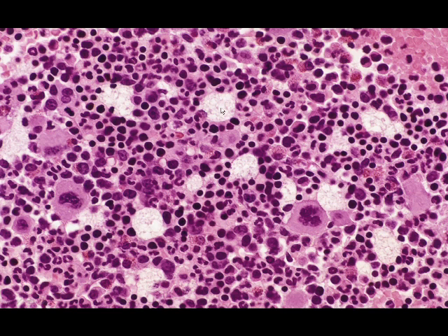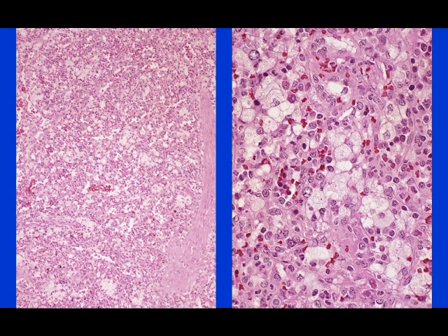In the biopsy section, we once again see scattered foamy histiocytes throughout this biopsy section, and simply mixed, not forming lesions, but mixed in with the hematopoietic tissue. This patient had a splenectomy, had a huge spleen. Spleen was taken out, and here is the spleen, and once again you see sheets of these large foamy histiocytes. So not specific, but a clue in this circumstance and in this age group that maybe we should look for storage disease and specifically focus on Niemann-Pick.